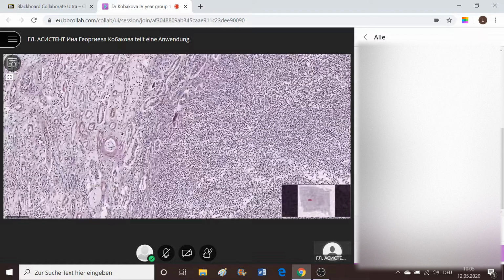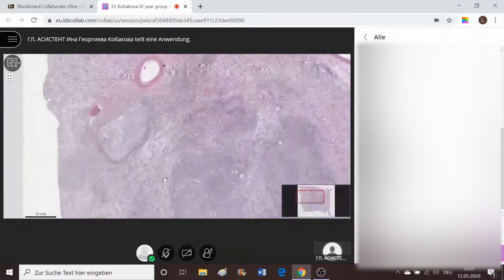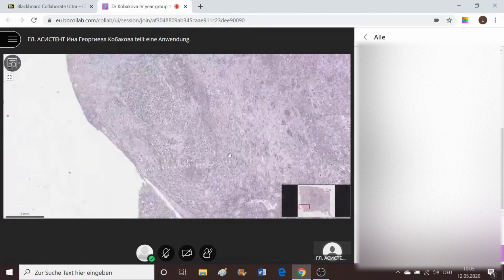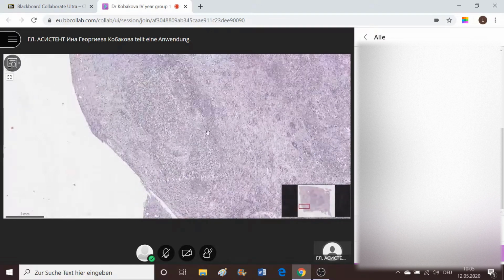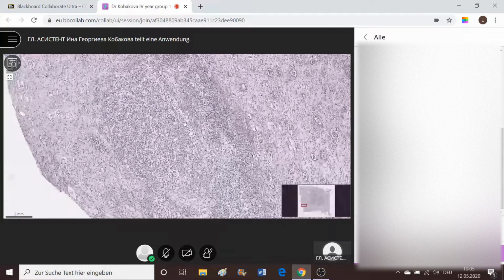So again, granulation tissue at the pyogenic membrane, an abscess cavity which is filled with neutrophilic leukocytes. This is what we should observe at this type of slide. So if you increase a little bit more this field, you will pay attention on the idea that one more abscess cavity is trying to form here. Again, an abscess.